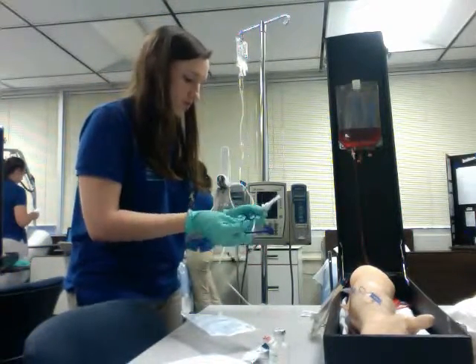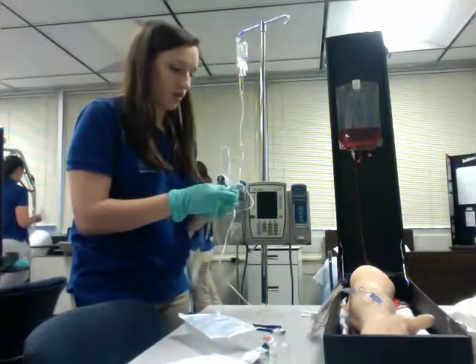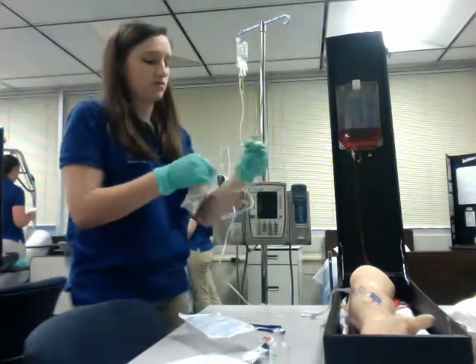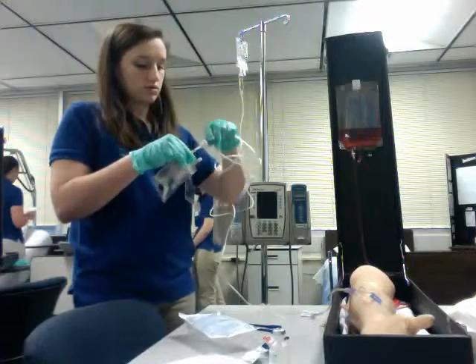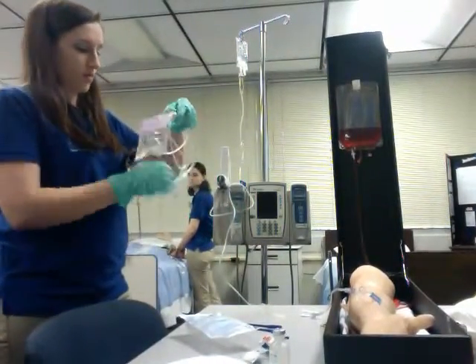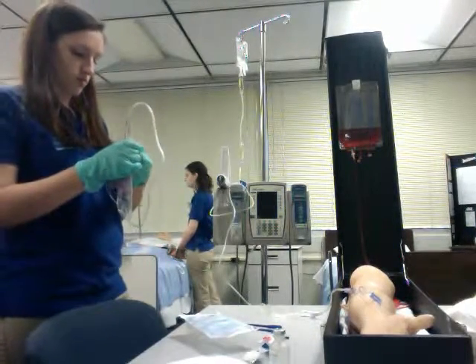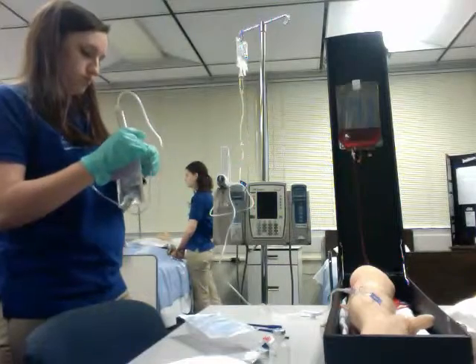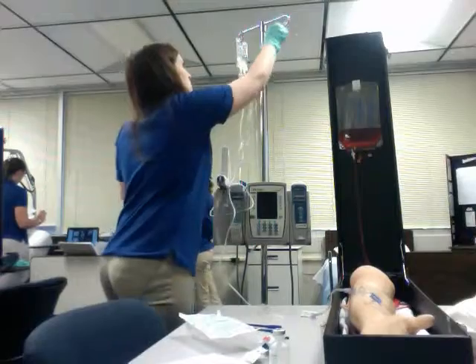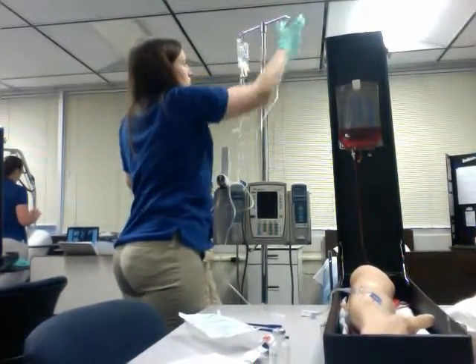Again, check the allergies and assess the patient. So the dose is 3 grams every 6 hours. It comes in a 3 gram vial, so you reconstitute with 6 milliliters. And I have that here. Make sure I have it clamped off. And 3 grams of Zosyn. And it's going to be going in over an hour. And the 6 milliliters is going to be going into 50 milliliters of saline.